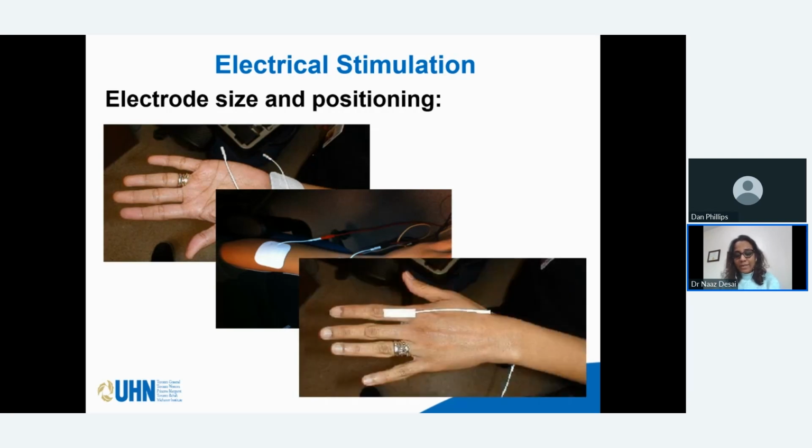And then here we are really stimulating the lumbrical muscle. So really thin electrode, again, mostly related to specificity of stimulation. We'll get into the details of it, but just to quickly mention, this kind of electrode is used when we are stimulating to produce a very specific type of grasping pattern, which is called the lumbrical grasp.